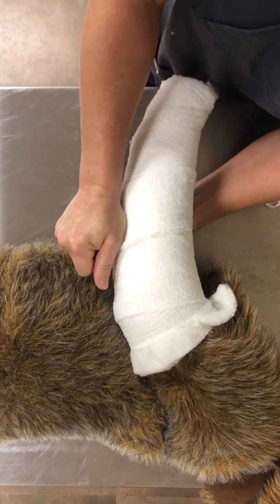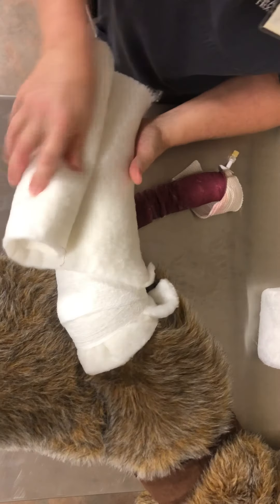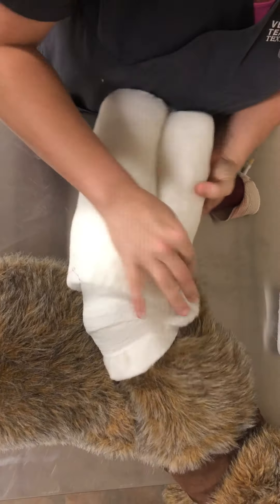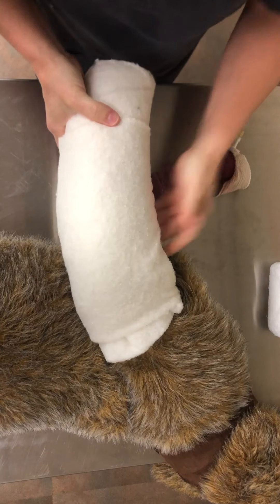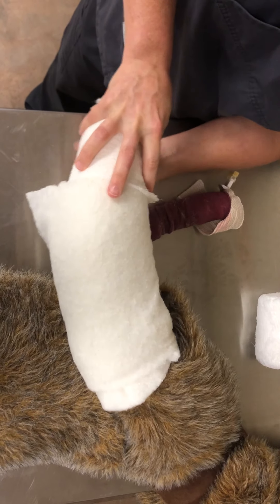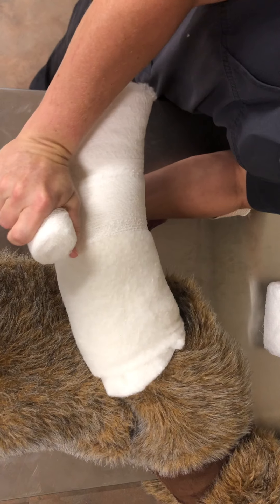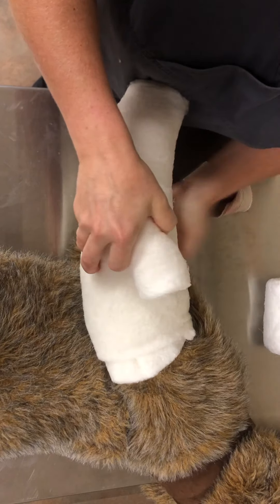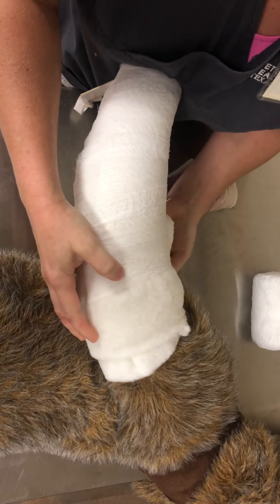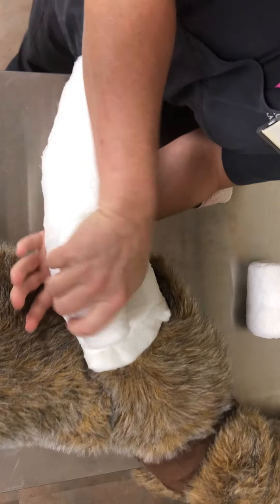Notice we cut that down in size by compressing. To make a true Robert Jones, we probably need to add another layer of padding. Pull that snug again just like we did in the beginning, try to get it to lay flat, and we'll go back again with our stretch gauze to see how much we can compress it. The goal is to make this nice and thick and difficult for your patient to move. This is especially useful for really large and giant breed dogs where it's difficult to find a splint that fits.